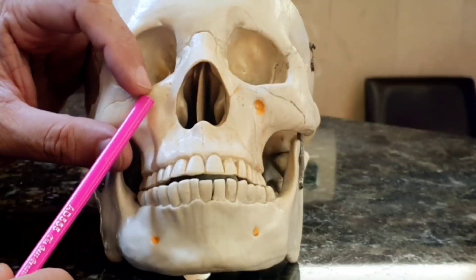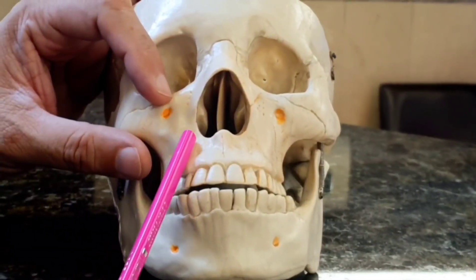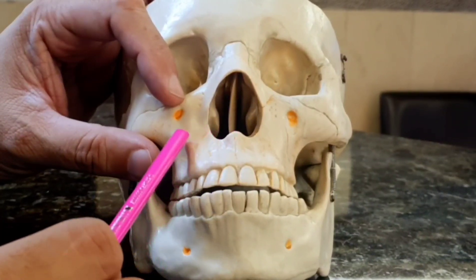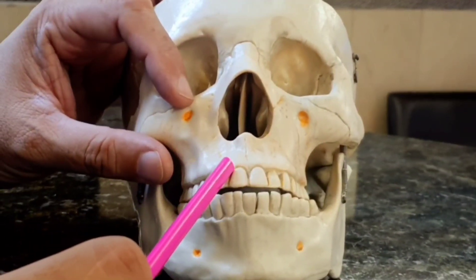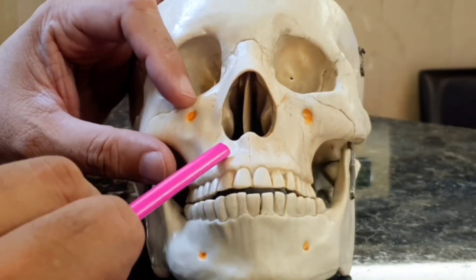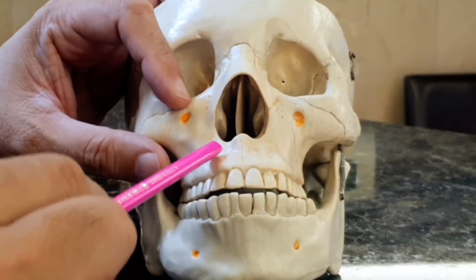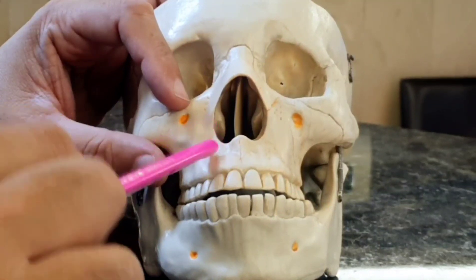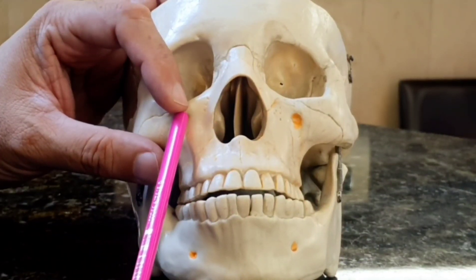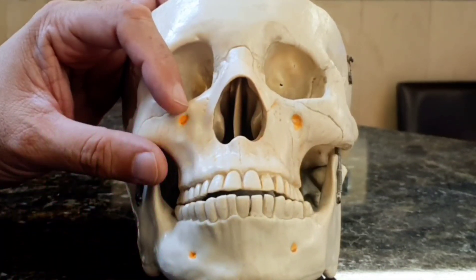Rarely would you need to give this infraorbital block, because the majority of the time when you give infiltration right close to the apex of the individual teeth anteriorly, you would get this region. Occasionally you would need this block in case there is a huge abscess at the canine, lateral, or central incisor and the anesthetic is not being effective. Then you go to the source — the infraorbital notch where the nerve comes out — and you'll get it at that point.